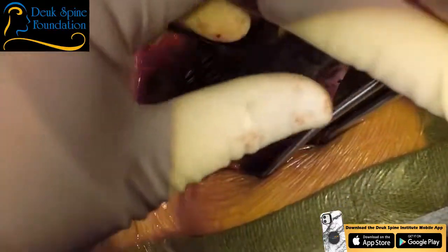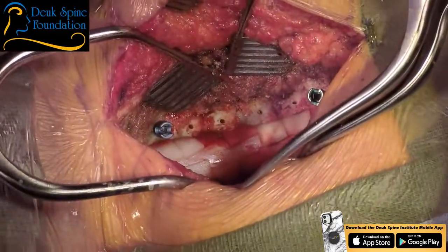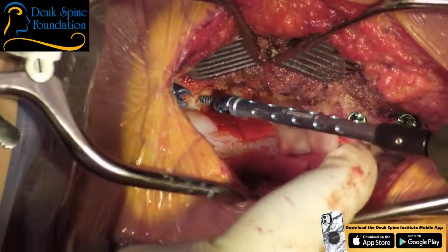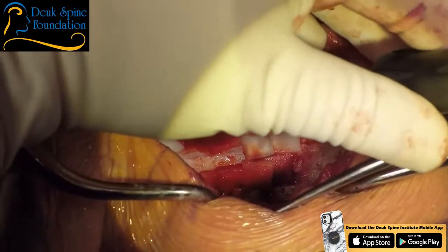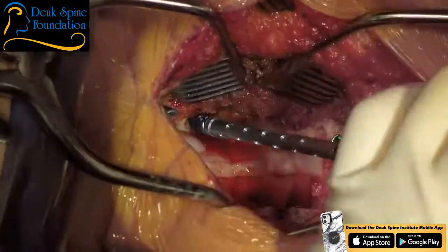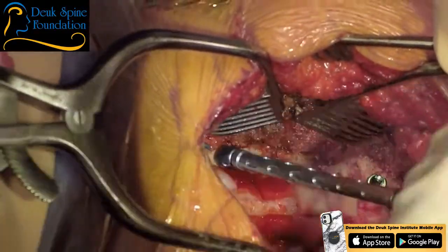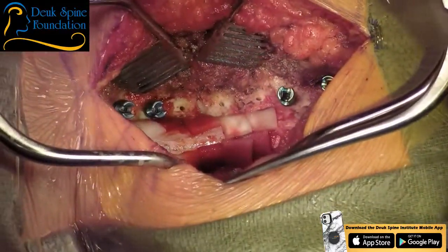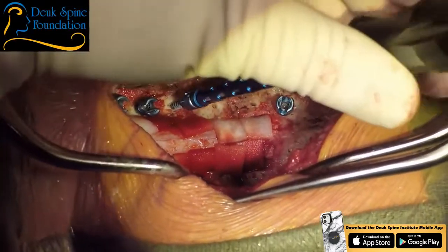I know I go bicortical. Sometimes I can feel it, but I've never had a nerve root injury. I've never had a vascular injury with 14, but I would never go 16. 14 is it. You could probably even get away with 12 millimeter screws. Make sure you don't seat them on the bone, otherwise they lose their polyaxiality. So you want the head of the tulip to be able to move around and grab the rod and reduce the spine to the rod.